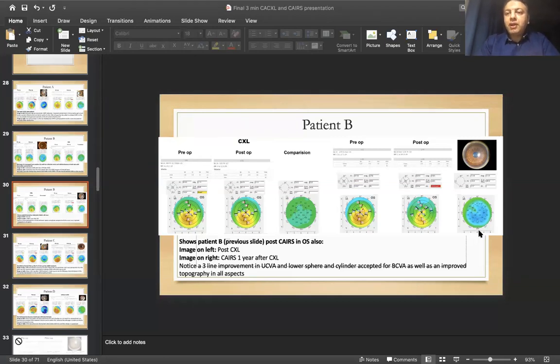But my question to you: do you think that the aim of the intracorneal ring segment implantation is just implantation of tissue, adding? In another way, I can ask this question. Is the principle of the intracorneal ring adding something inside the cornea, or adding a material which can stretch the cornea?